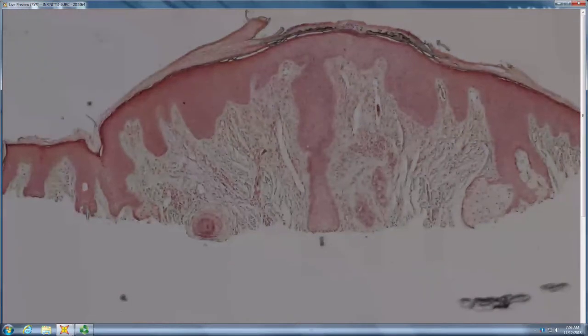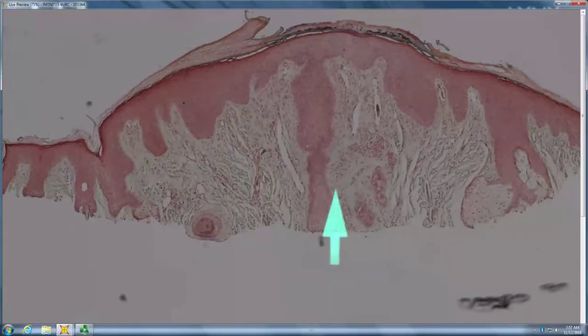Alright, so there's kind of this irregular acanthosis. It kind of looks like there's vertical collagen, maybe like an LSC. But it's definitely a bump, right? And where do you think this bump is, given the small adnexal structures and prominent sebaceous glands? On the face, perhaps even the nose.